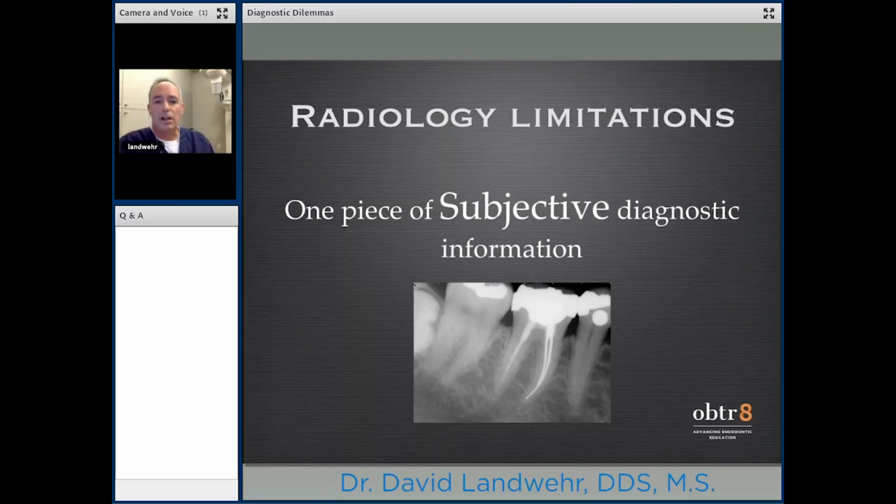Is the radiology something that we can use to add to what we know? And I think the answer is absolutely it is. But many of us, and me included, fall into this trap. We treat the radiograph, we use the radiographic evidence as a panacea and say, well, there's radiographic change.